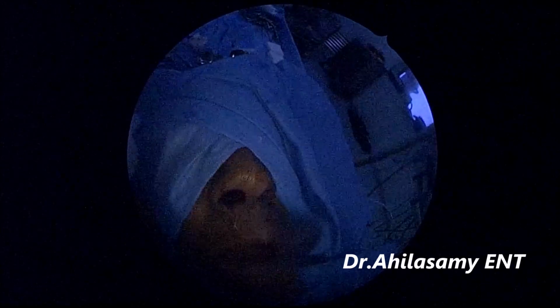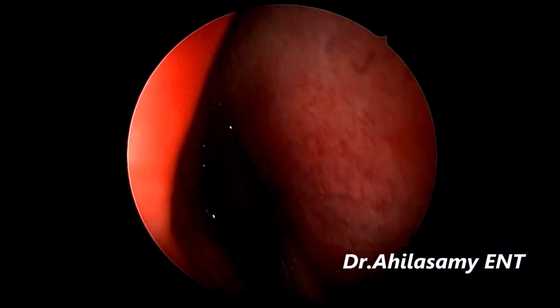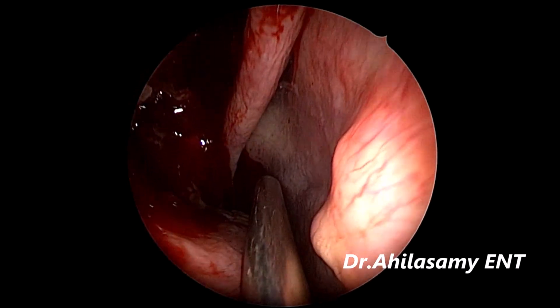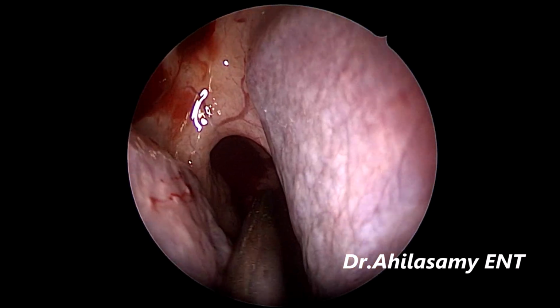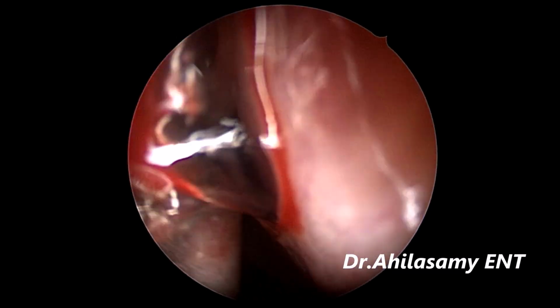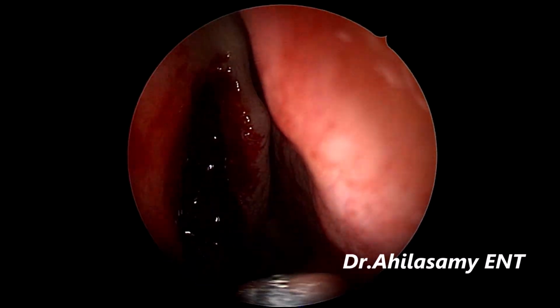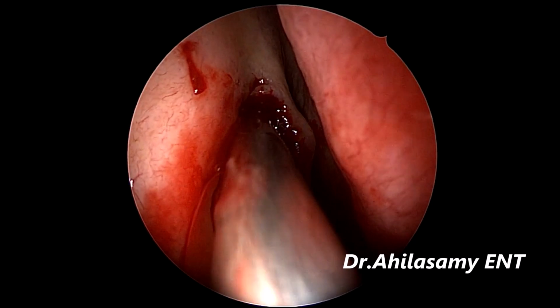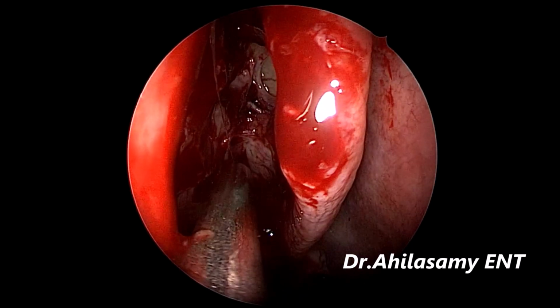Patient is very comfortable. Even though in this video I haven't shown the anterior ethmoidal block, which I gave on both the sides, I edited it out. Suck it out. See the sphenoethmoidal recess area also.